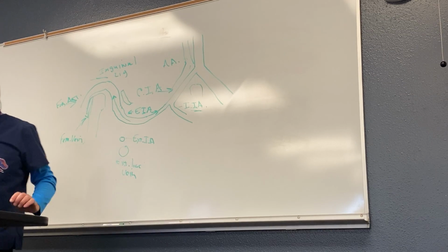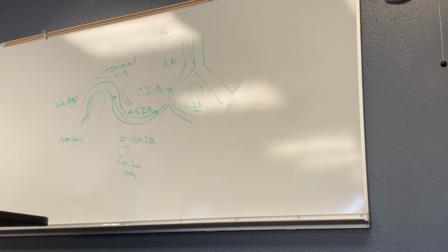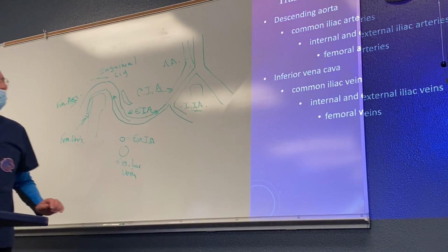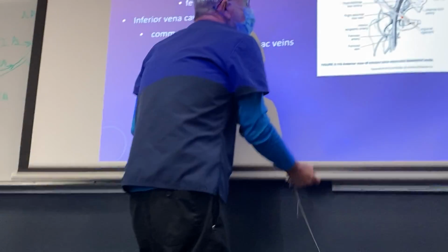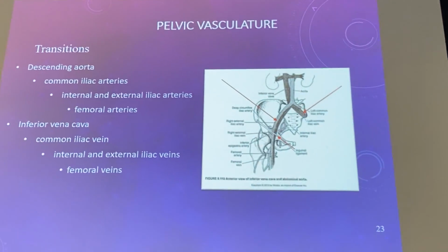Let's look at it from a sectional perspective, see if I can get this baby back on. Wonderful. First time in history that's happened. Okay.